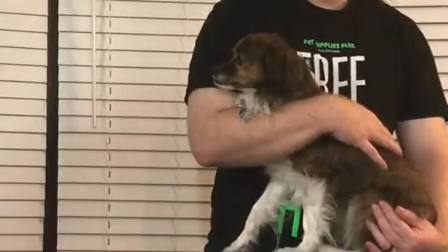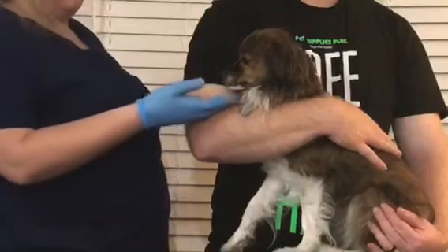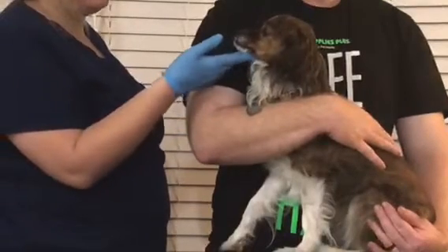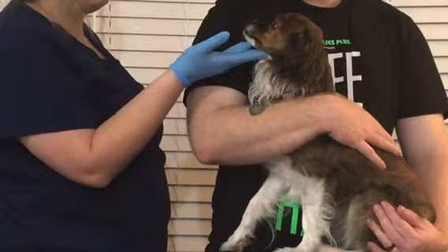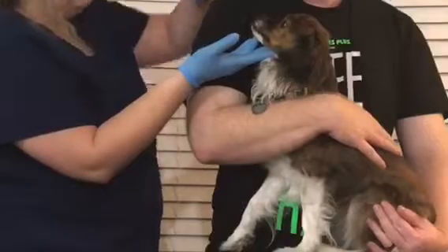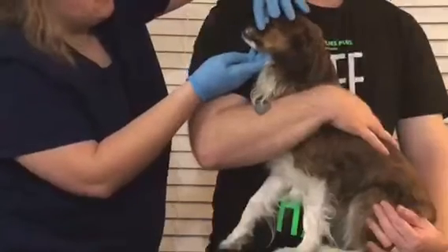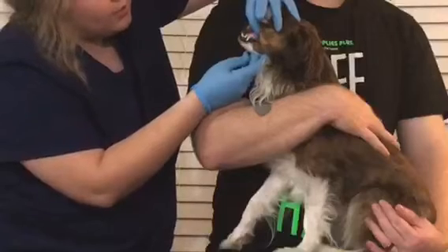To begin the closed mouth portion of the oral exam, make sure your patient is properly restrained. Place one hand under the patient's chin to keep the head lifted. Using the other hand, gently raise and separate the lips until the teeth and gums are clearly visible.